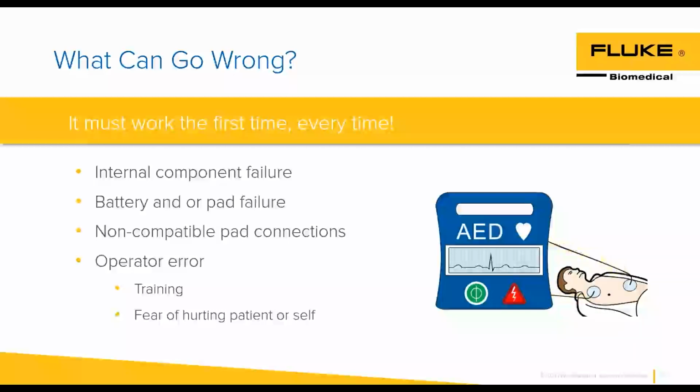And it just doesn't happen with your average citizen. This is also hospital employees. How often do your hospital employees, your clinicians, actually discharge a defibrillator? Are they familiar with saying the word shock and knowing that it's not going to hurt the patient?